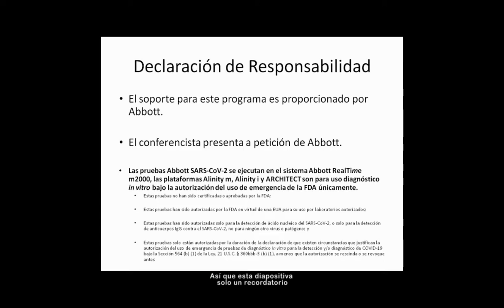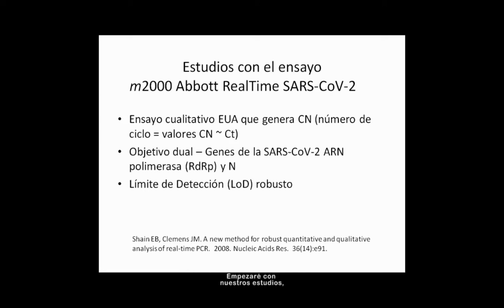So this slide is a reminder of emergency use authorization and what that means. I'll start out with our studies with the Abbott M2000 real-time SARS-CoV-2 assay. That assay is a qualitative emergency use authorization assay that generates either positive or negative results.